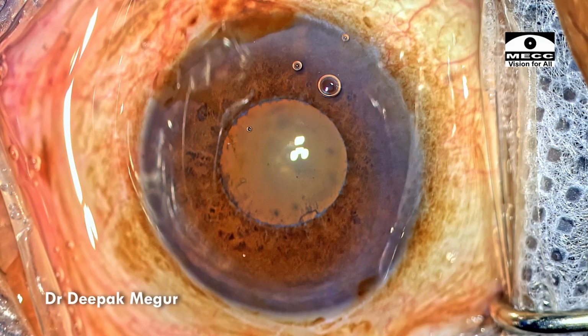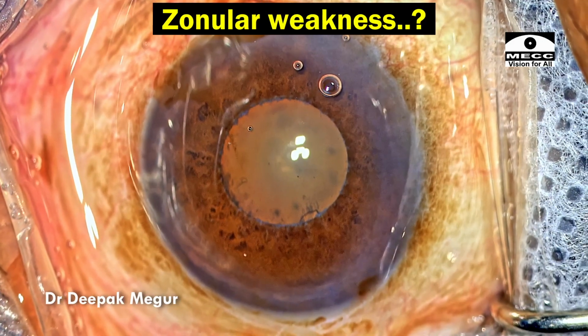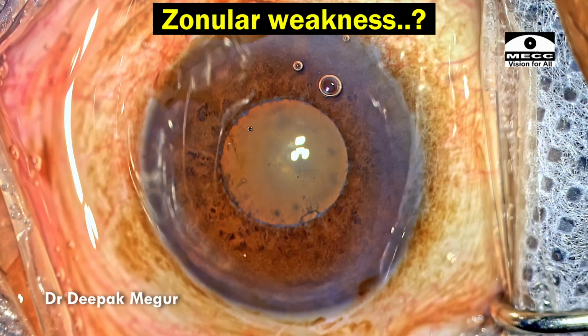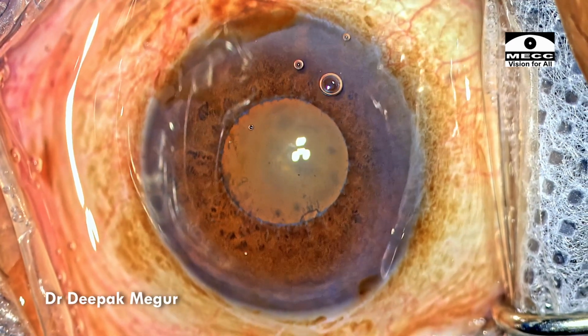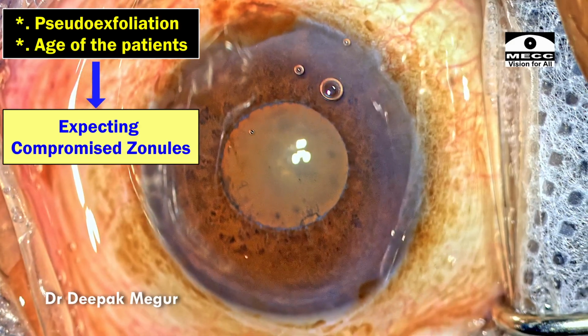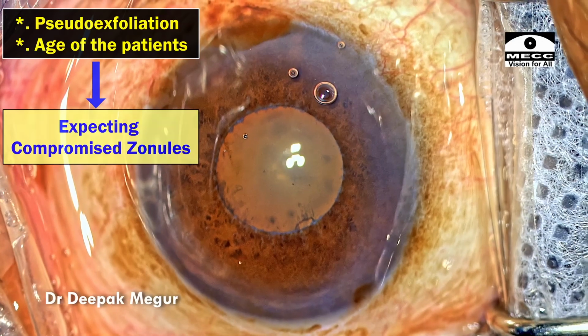It's not marked, but the strength of zonules in these cases can be tested only when we puncture the anterior capsule. So until then, it's extremely difficult to just imagine. Looking at the scenario of the pseudoexfoliation and the age, I'm expecting a compromised zonular weakness. Let us see how things turn out.